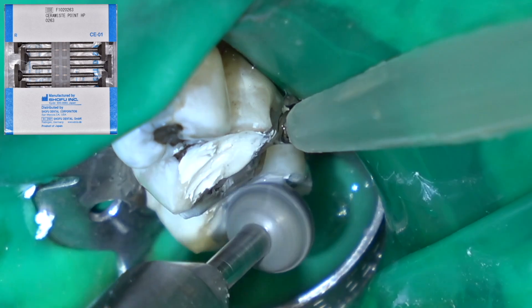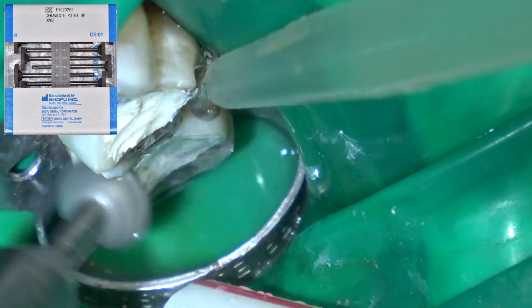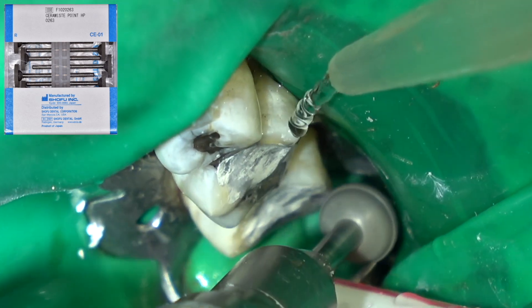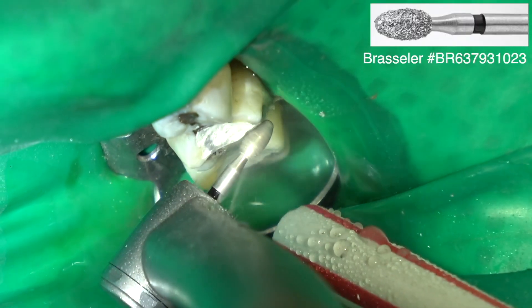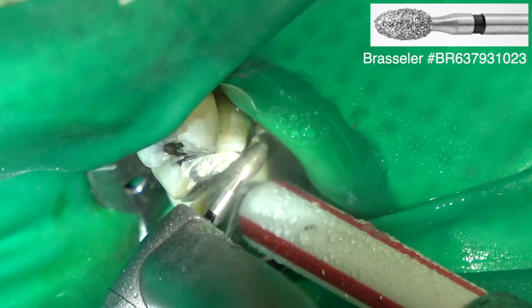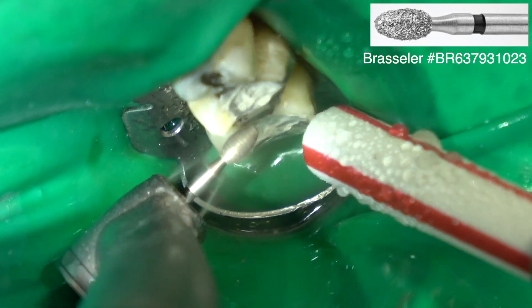Then once it sets, I come back with this rubber wheel sometimes and just polish it a little bit. Round the edges so you don't have any sharp edges. We're obviously going to place crowns on these teeth at a forthcoming appointment.